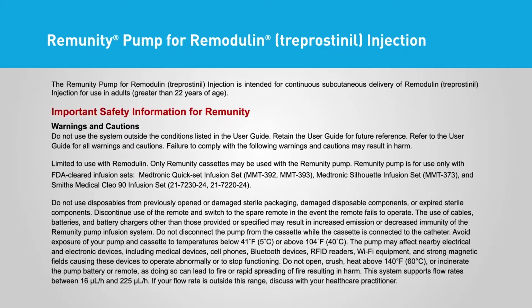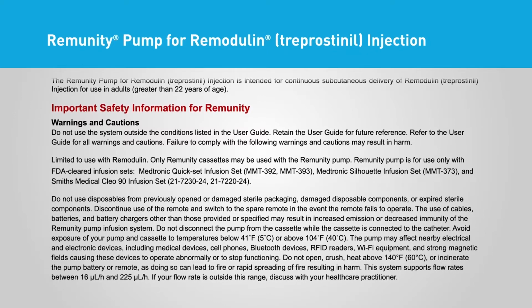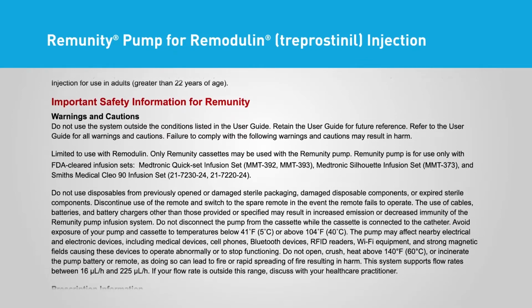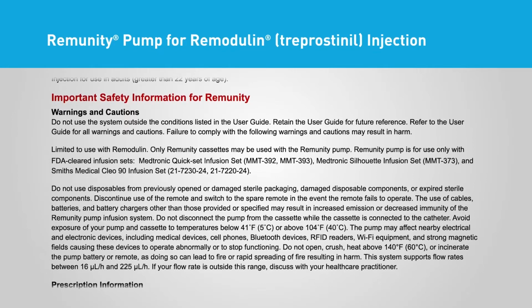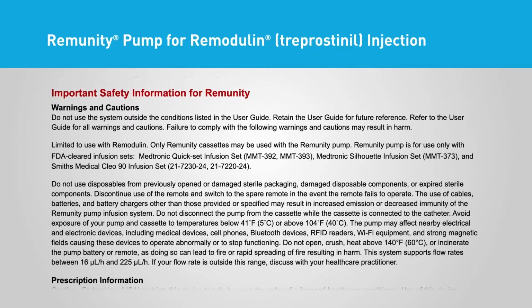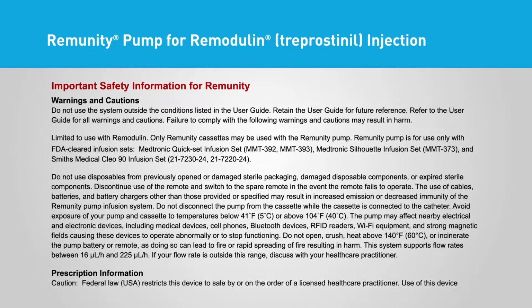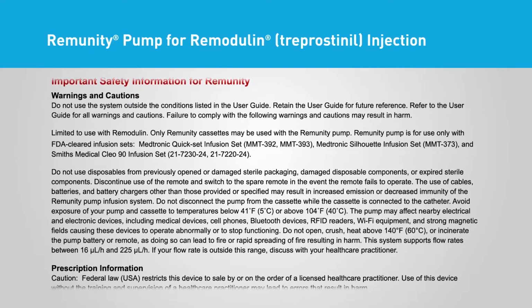Medtronic Quickset Infusion Set, MMT-392, MMT-393, Medtronic Silhouette Infusion Set, MMT-373, and Smith's Medical Clio 90 Infusion Set, 21-7230-24, 21-7220-24. Do not use disposables from previously opened or damaged sterile packaging, damaged disposable components, or expired sterile components. Discontinue use of the remote and switch to the spare remote in the event the remote fails to operate.